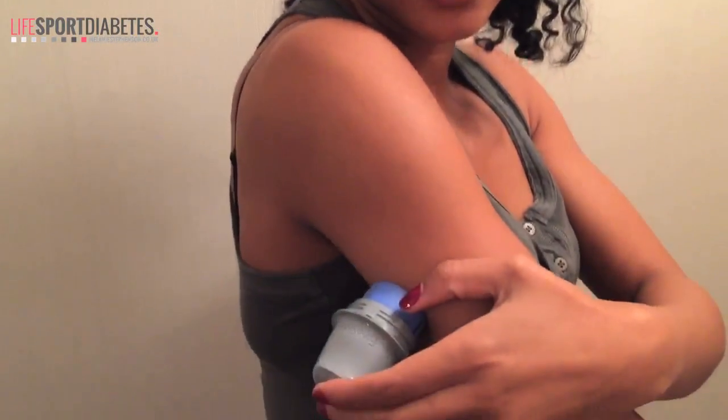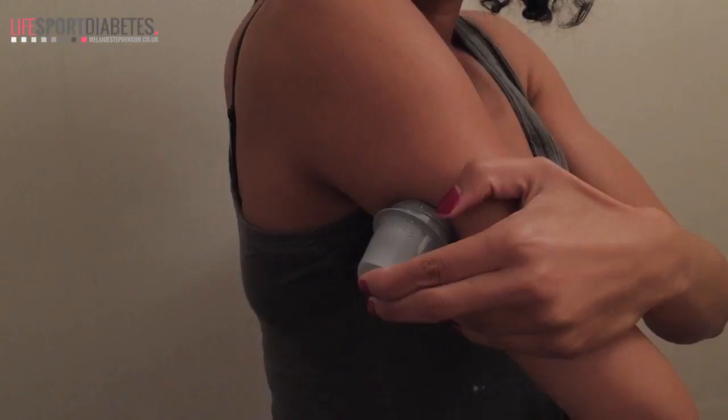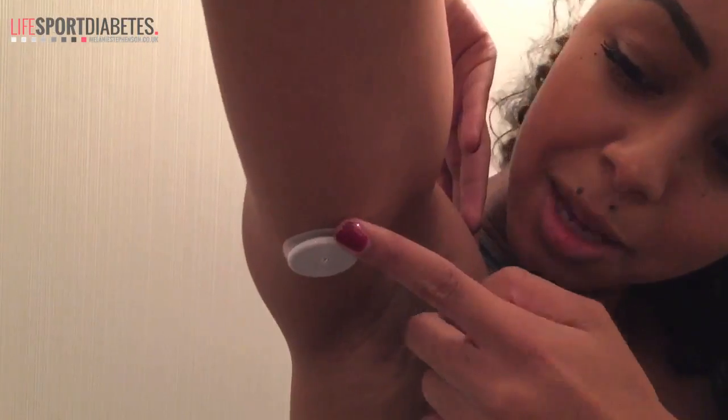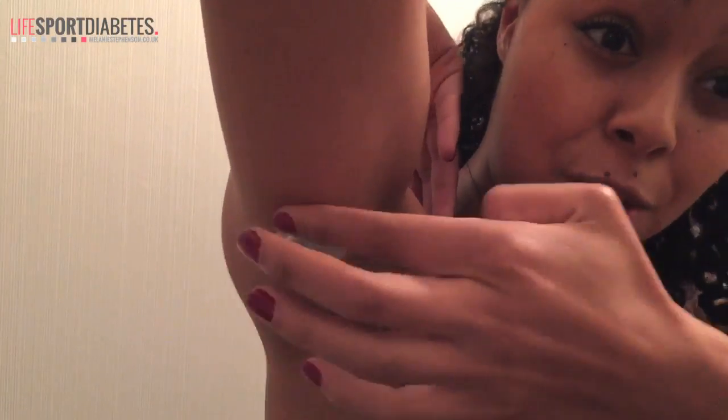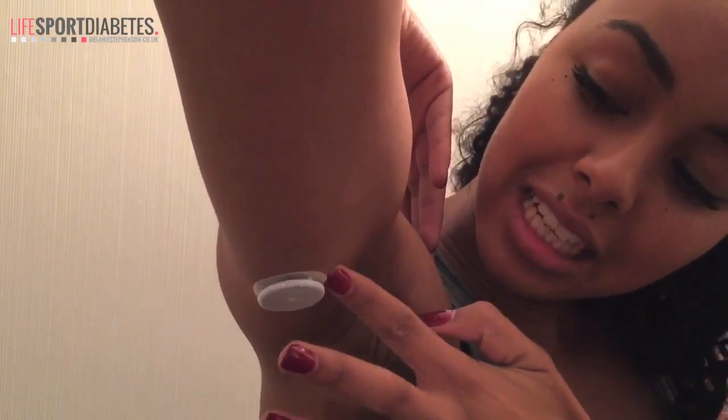Now I'm going to attach the sensor — it just involves pushing the applicator into my arm and you'll hear the click. The next step is that you just need to secure the sticky plaster around the sensor to make sure that it's well attached.